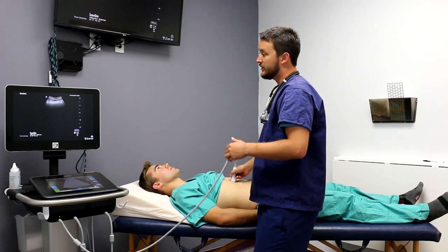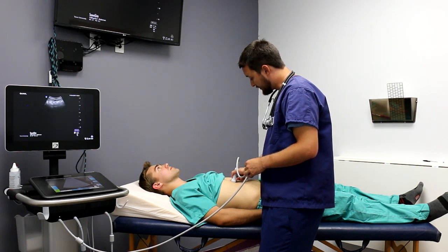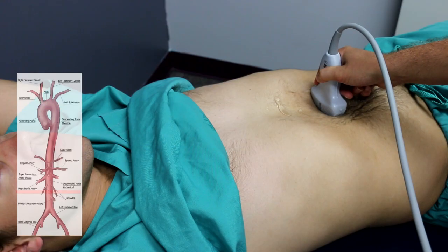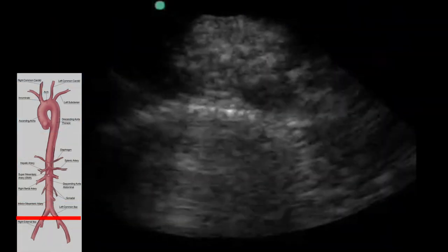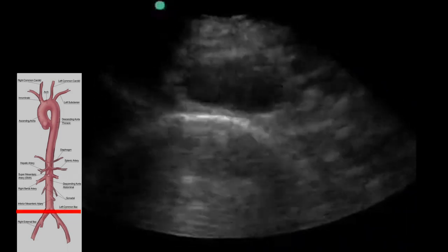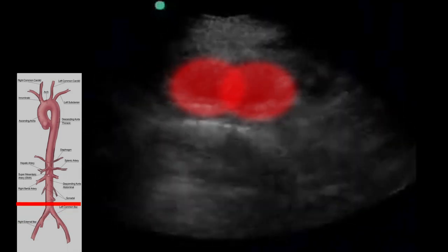Make sure you don't confuse these two vessels with the spine, which is right here. From here the exam is fairly straightforward. We simply slide the transducer down until we see the aorta splitting. We move the transducer back and forth to show the splitting of the aorta into the two common iliac arteries. We want to be sure to identify these vessels because this is how we know we've scanned the entire length of the aorta.